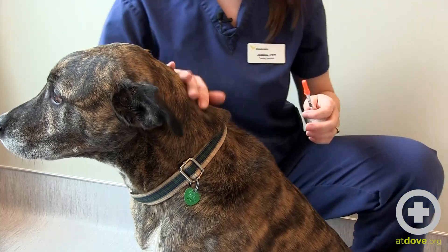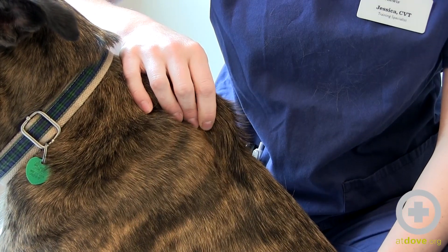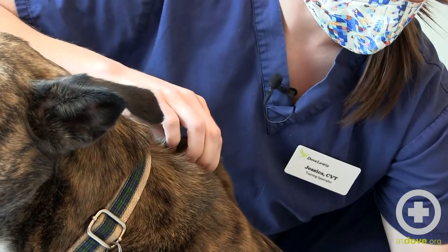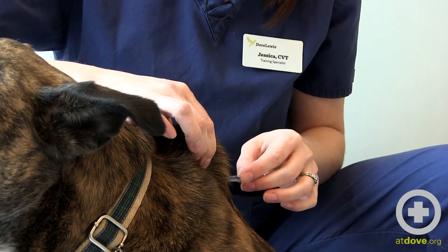He's going to be very cooperative. You're going to tent the skin like this — see how we have a little triangle back here that's tented. Then you'll remove your cap carefully and put it off to the side.